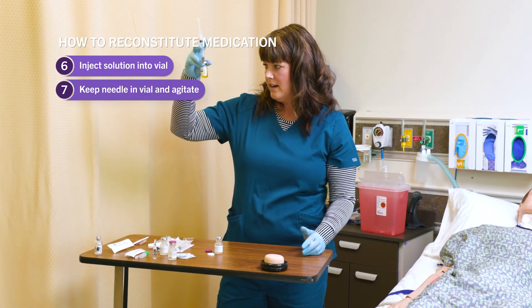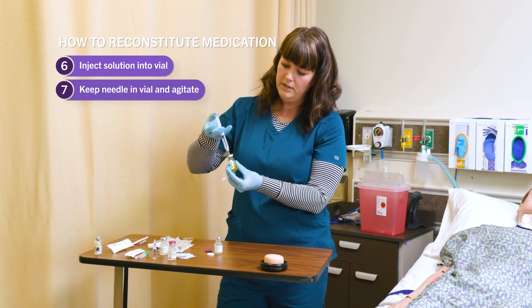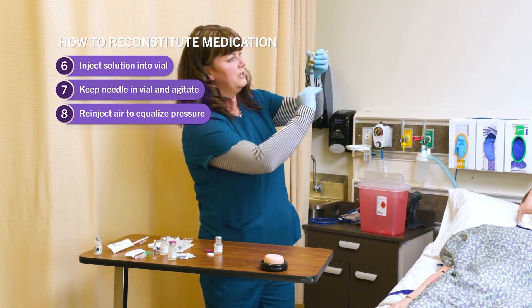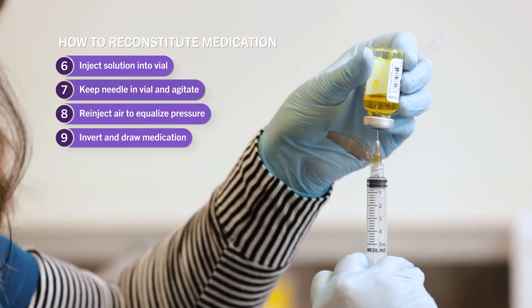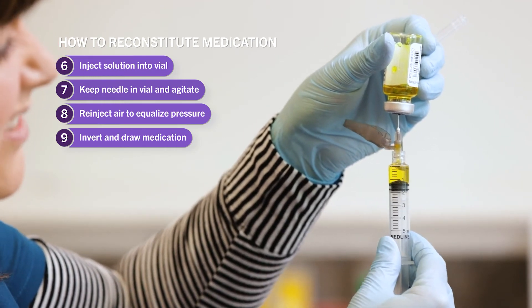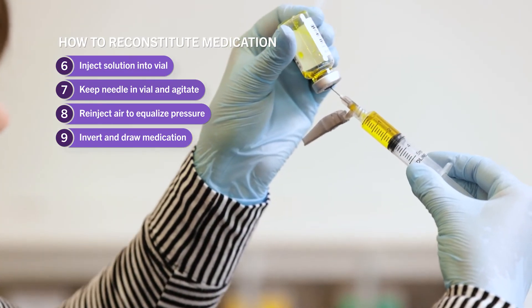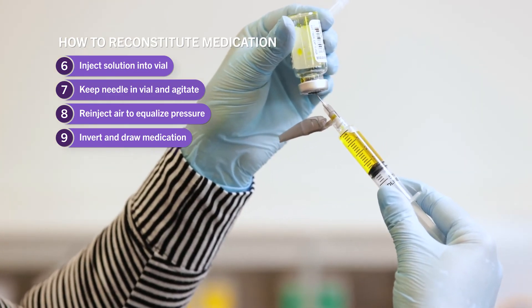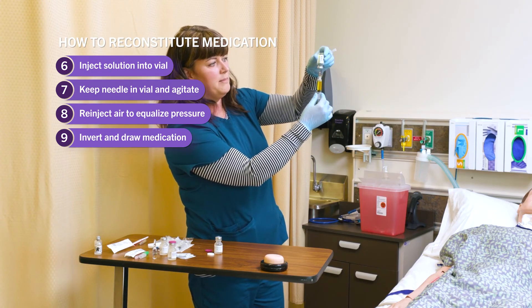Once I'm satisfied and the medication looks pretty dissolved, I'm going to re-inject that air to equalize the pressure and then invert. When you invert, make sure the tip of your needle is down in the solution, or else you're just going to be pulling back air. Once that's down in the solution, you can let go and it will pull in on its own. You have to carefully keep that bevel or needle tip in the solution to get out all of the medication.